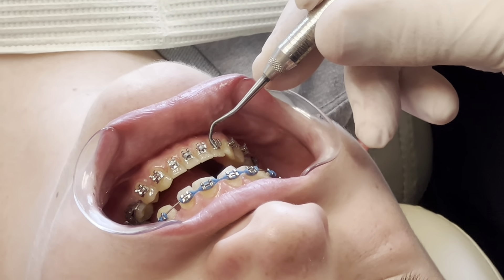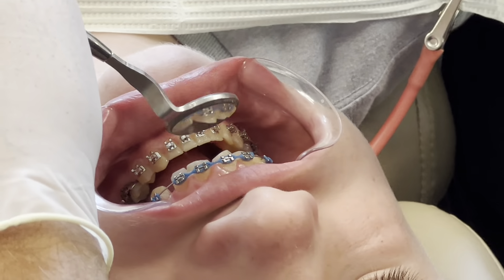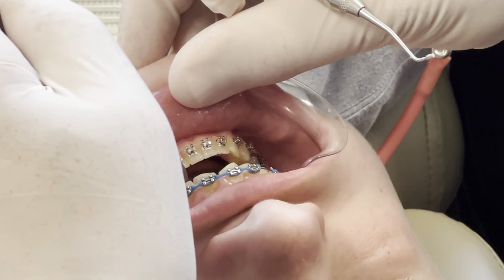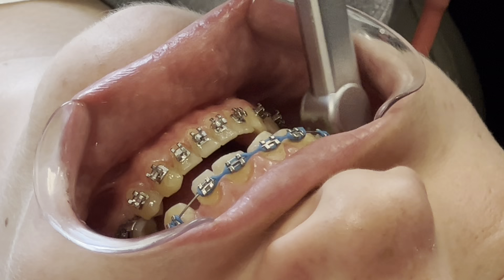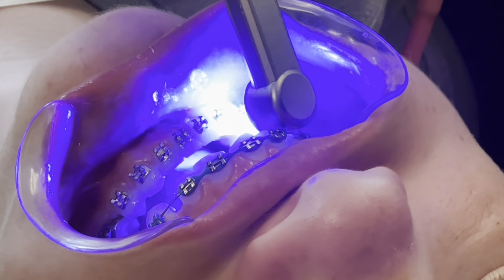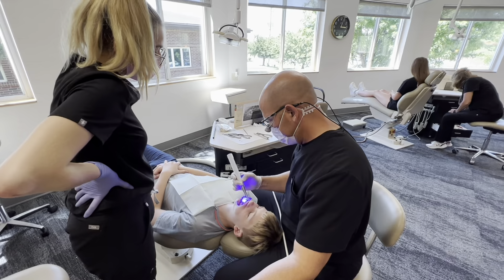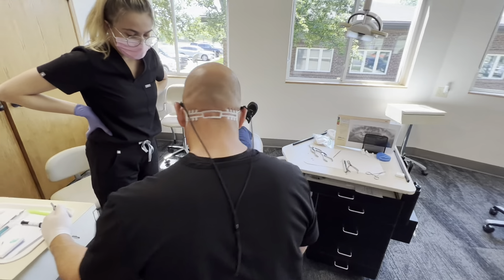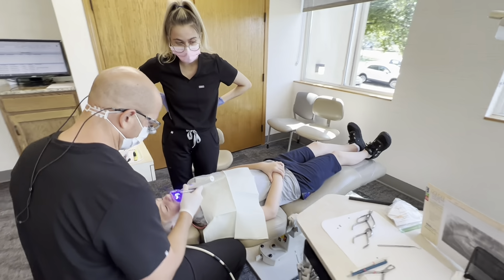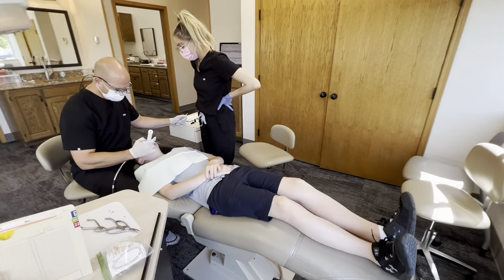I'm going to put that lower left five thing in. We'll see if we can get the bands on, and we need to do re-touching with all of this.